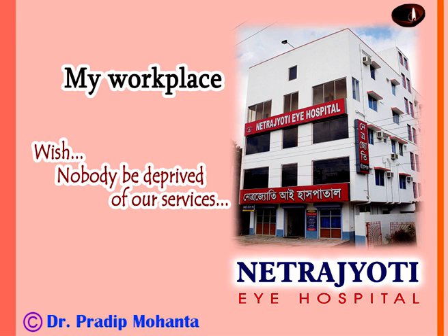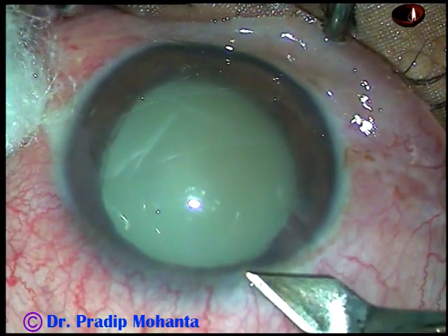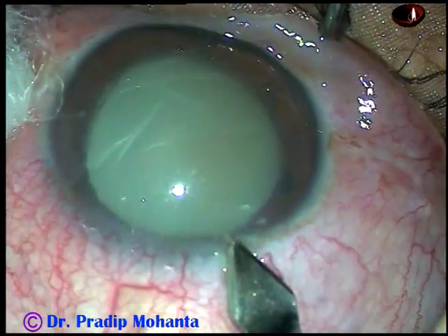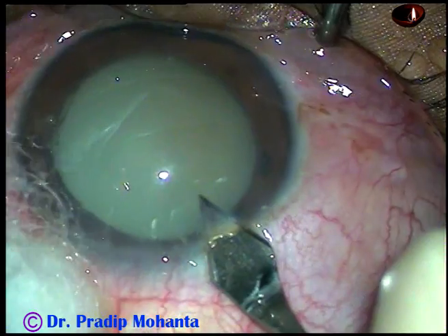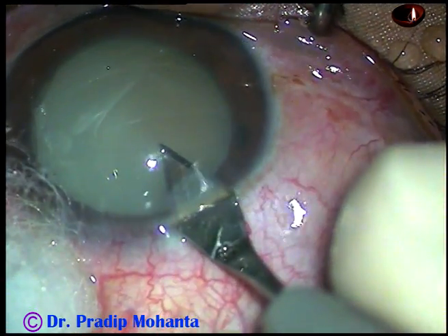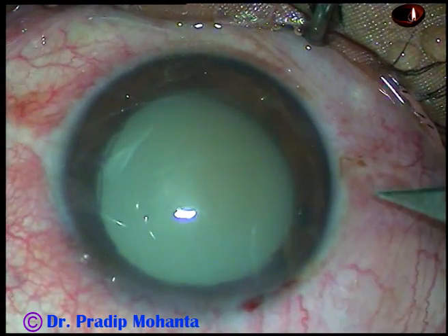Friends, welcome to my workplace at Ranaghat, West Bengal, India. You can see this is a hypermature morgagnian cataract with turbid anterior chamber. It is a case of phacolytic glaucoma. The patient came to me today with intraocular pressure of 56 mm of mercury.